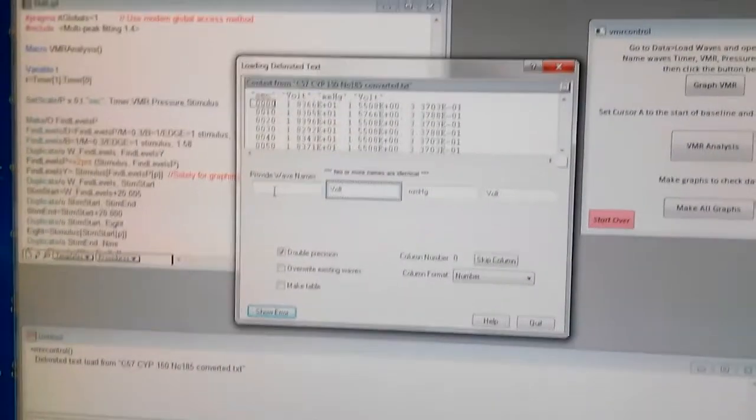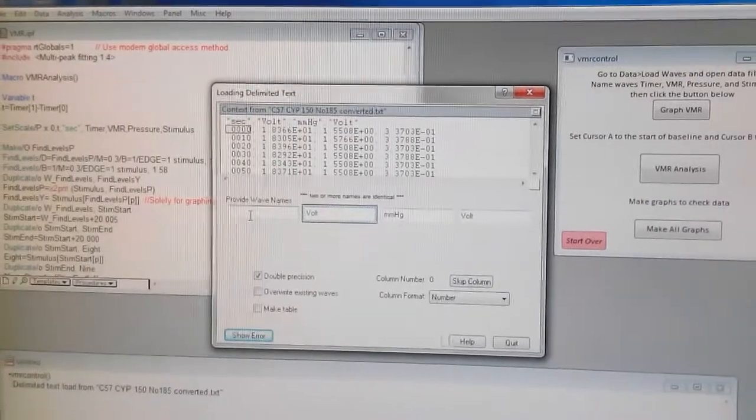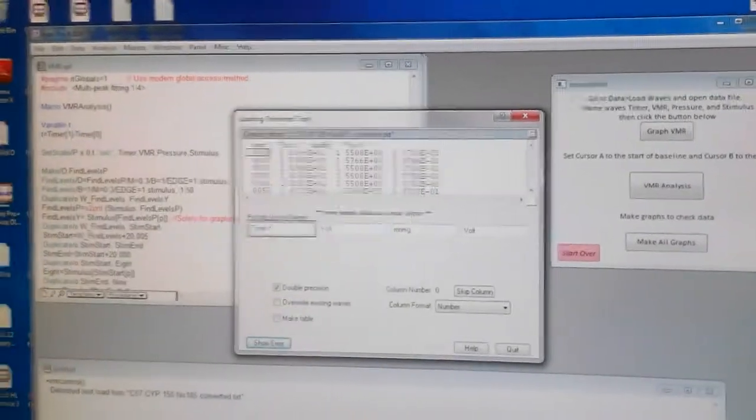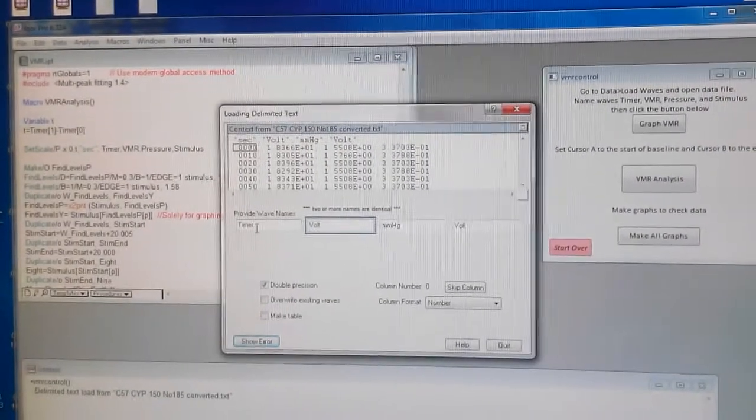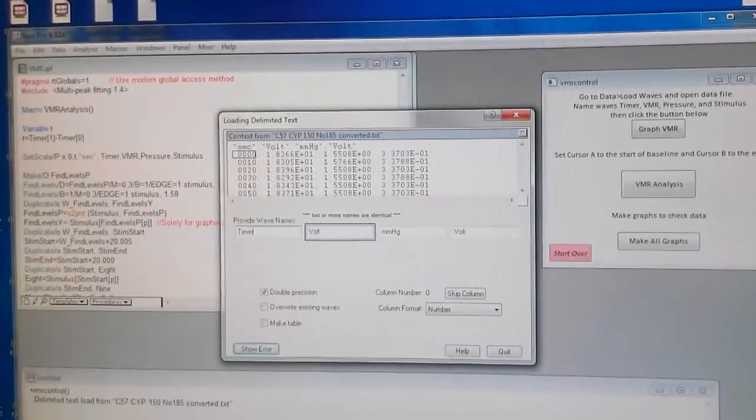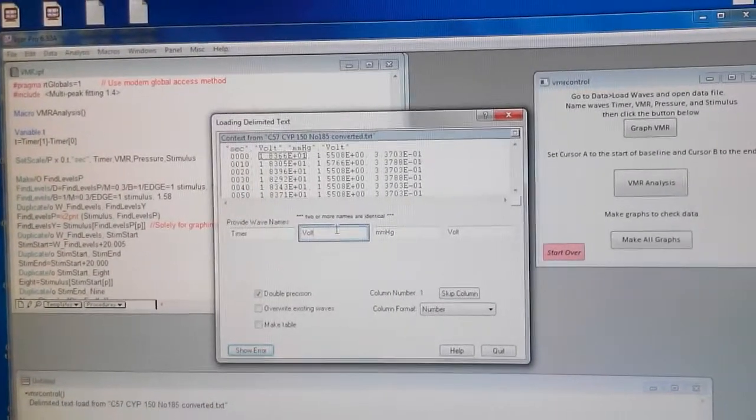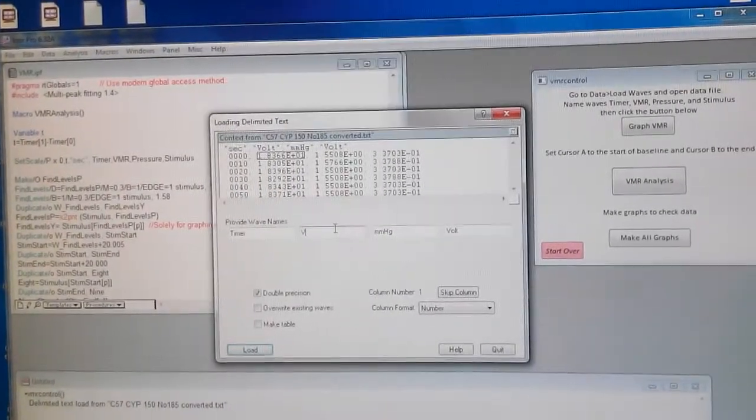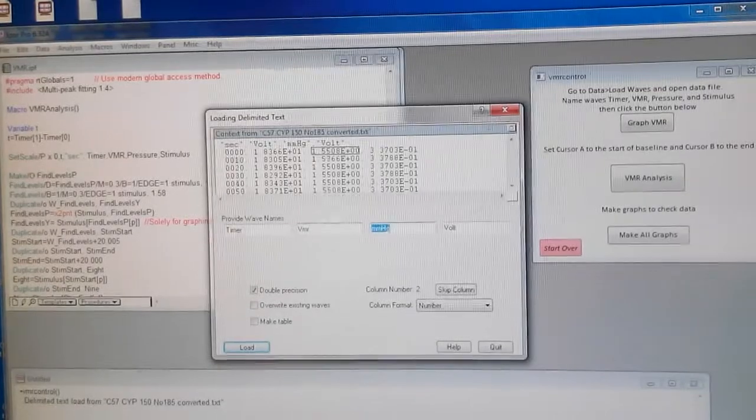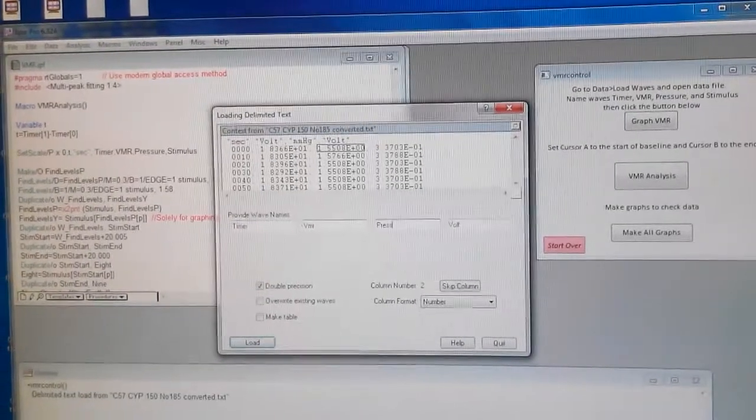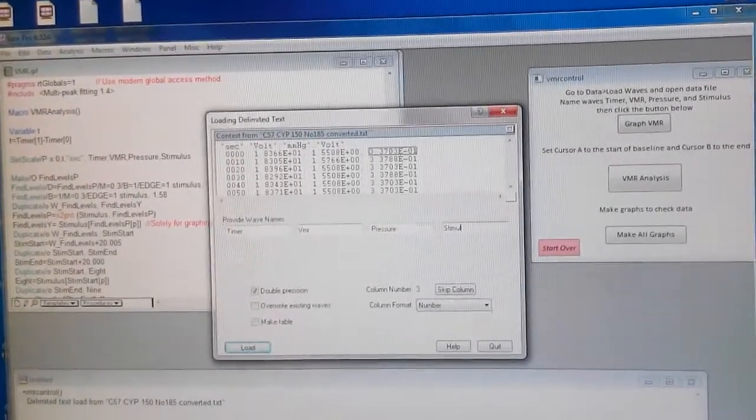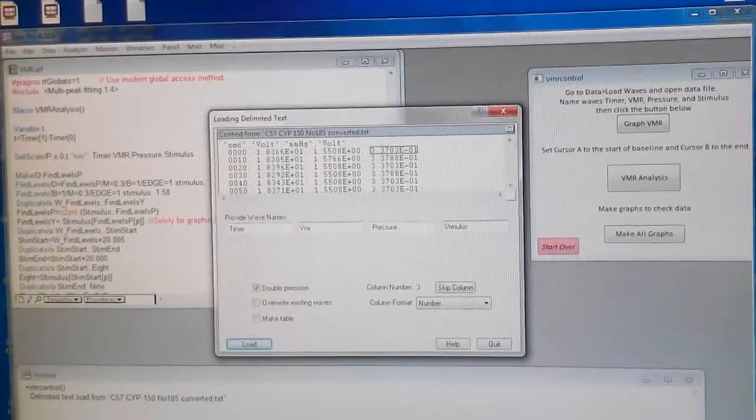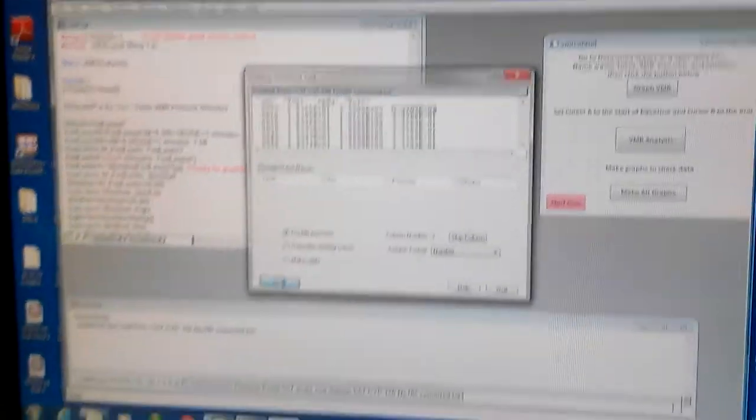Now you write, I think, fresh timer. Then you write V on this next one. You write VMR. You write pressure. The next one, stimulus. And you say load.